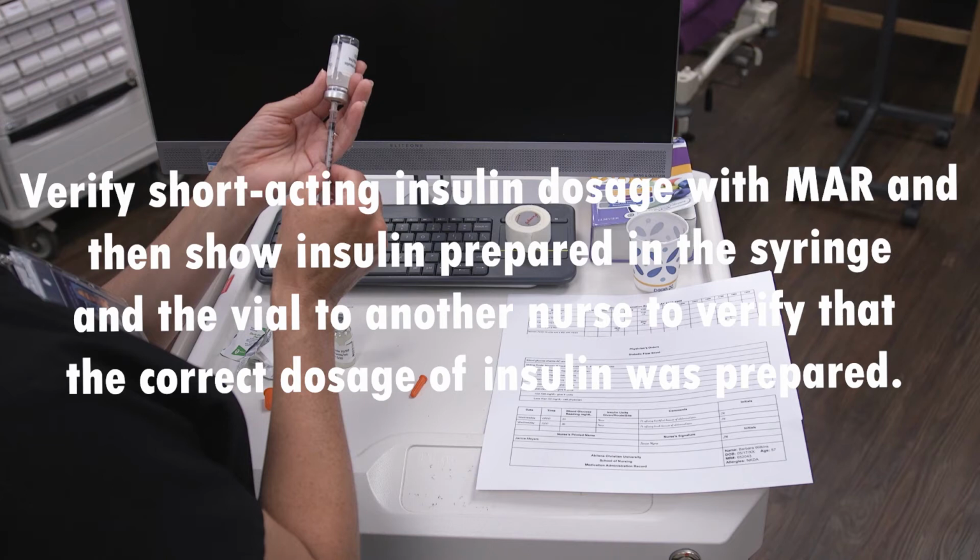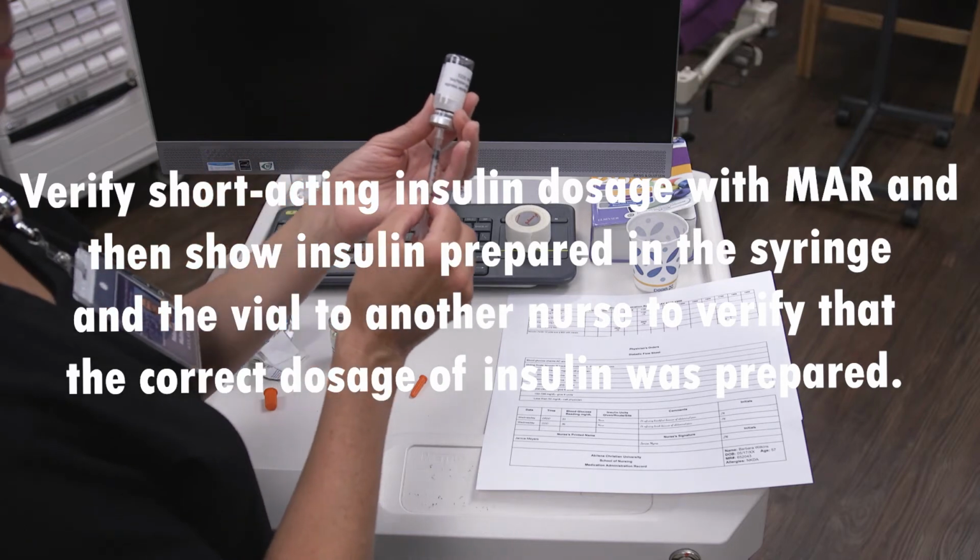Verify short-acting insulin dosage with MAR and then show insulin prepared in the syringe and the vial to another nurse to verify that the correct dosage of insulin was prepared.